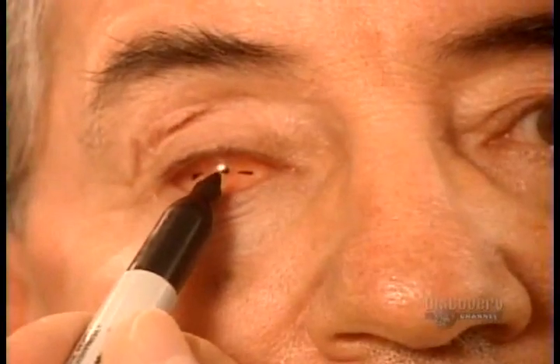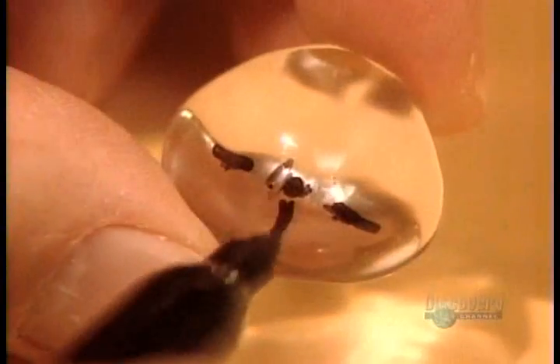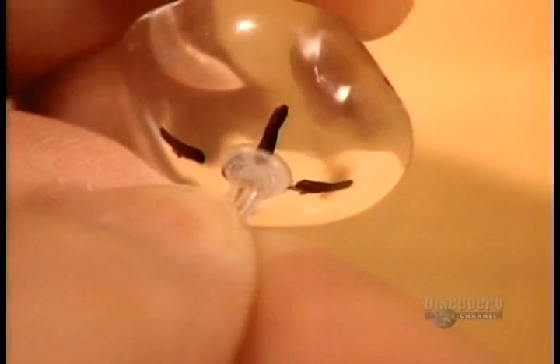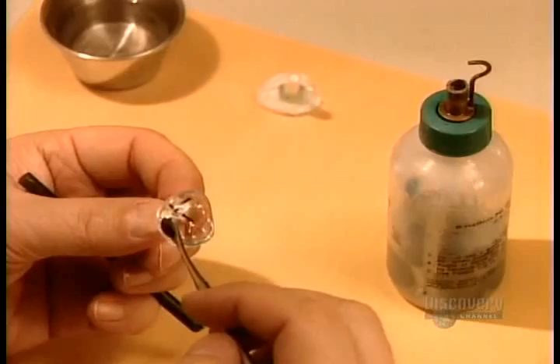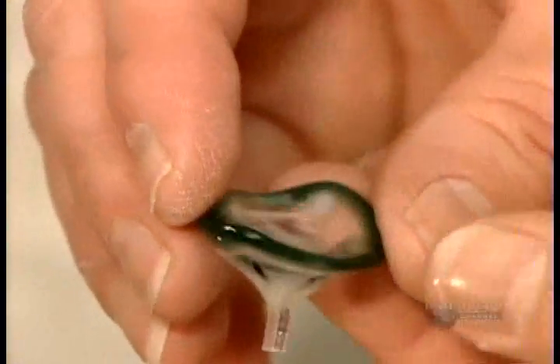This model is called the fitting shape because they use it to fit and mark the positioning of the fake iris. They accentuate the markings, then attach a peg with a drop of wax. The peg indicates the natural angle of the iris when the patient is looking forward. Next, they add wax around the perimeter to enlarge the fitting shape. This excess will give the ocularist some play afterwards for the final sizing.